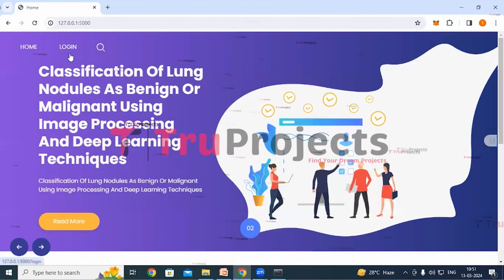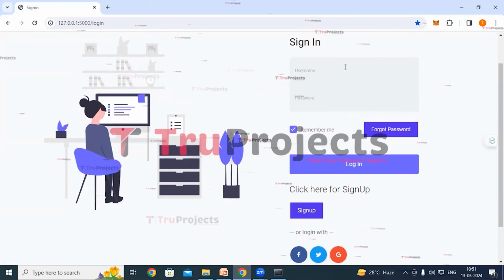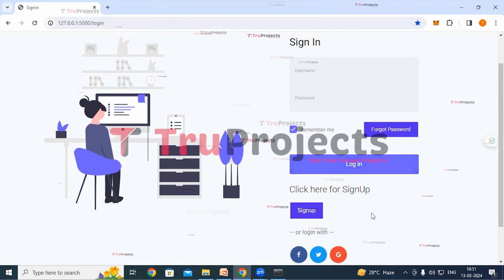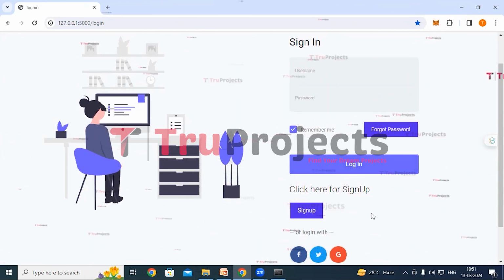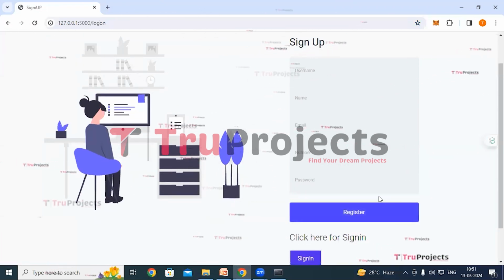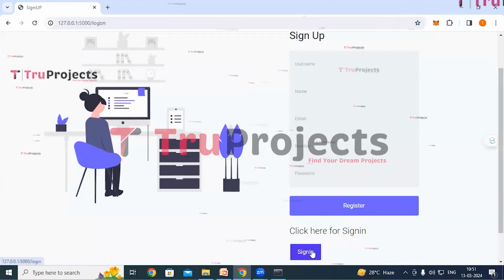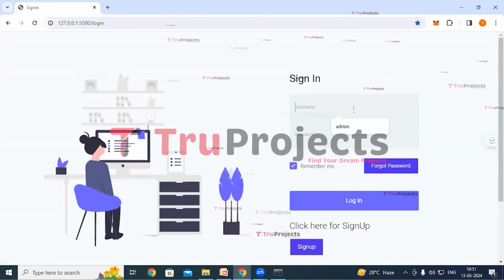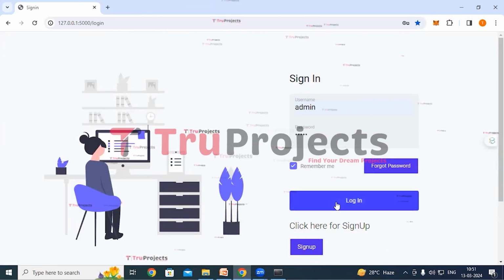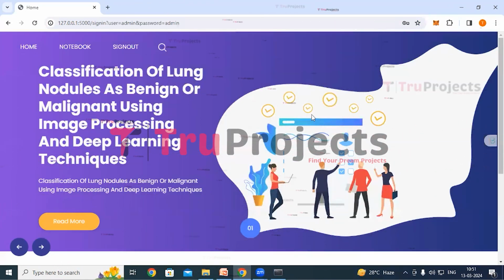This is the front end built using Flask framework. So here we can see a login link, click on it. So here we have to give our credentials, username and password and click on login button to sign in. And if we are new to the system, we have to register ourselves first. Click on sign up link. Fill in these details and click on register button to sign up. As I'm already a member, I'm clicking on the sign in link. Give the credentials here and click on login. So it has redirected us to the classification page.